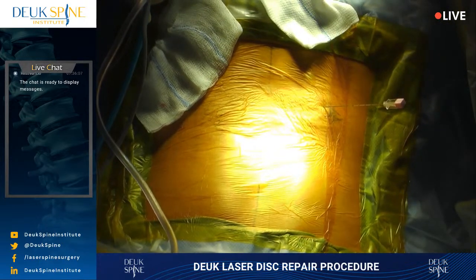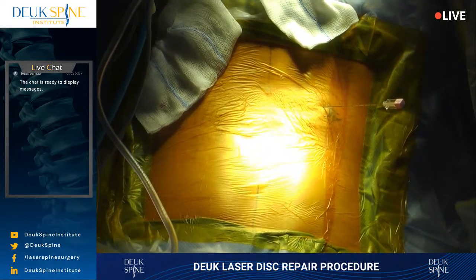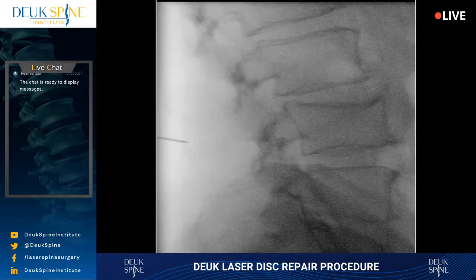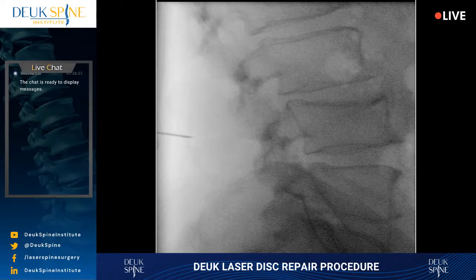Now, what the leg symptoms are due to is irritation of the nerves in the spine. Let's get some more numbing medicine, please. So the nerves that go down your legs that give you feeling and strength and bring pain signals up to your brain, those nerves, I'm just giving you more numbing medicine. You're fine, just lay still.